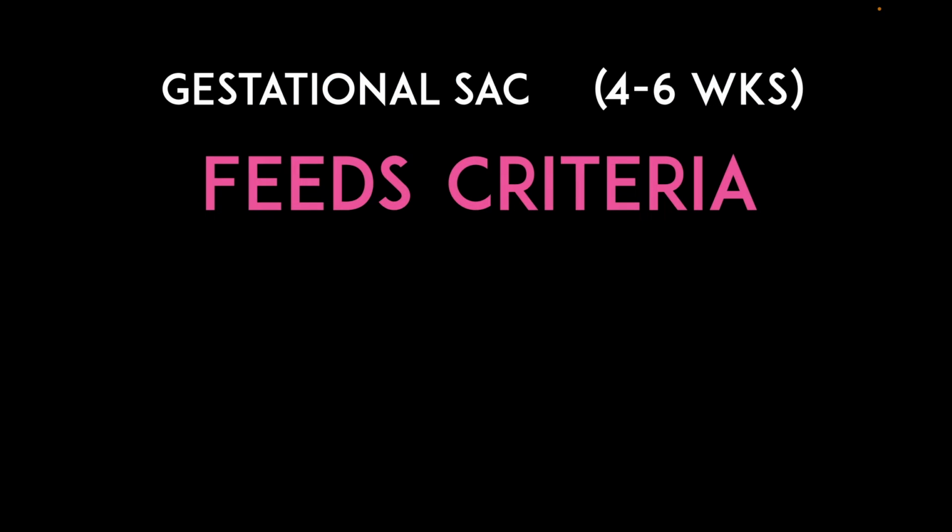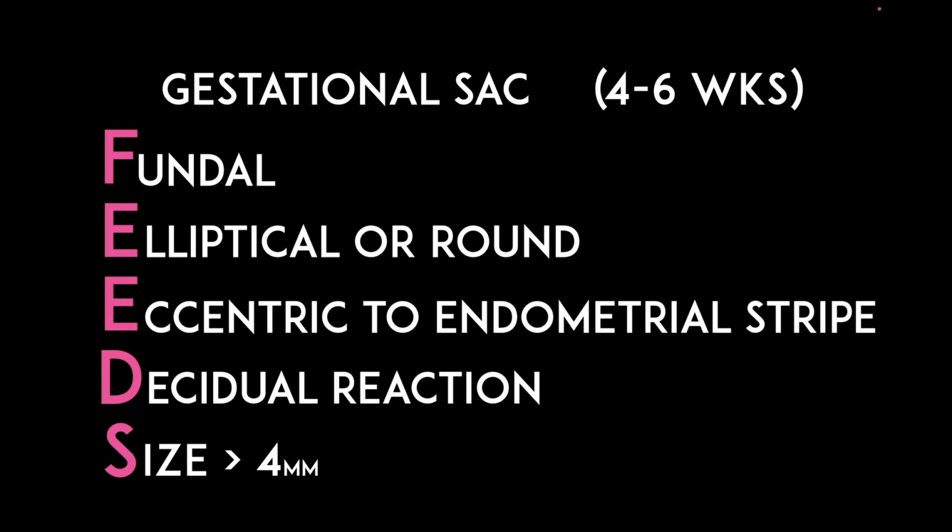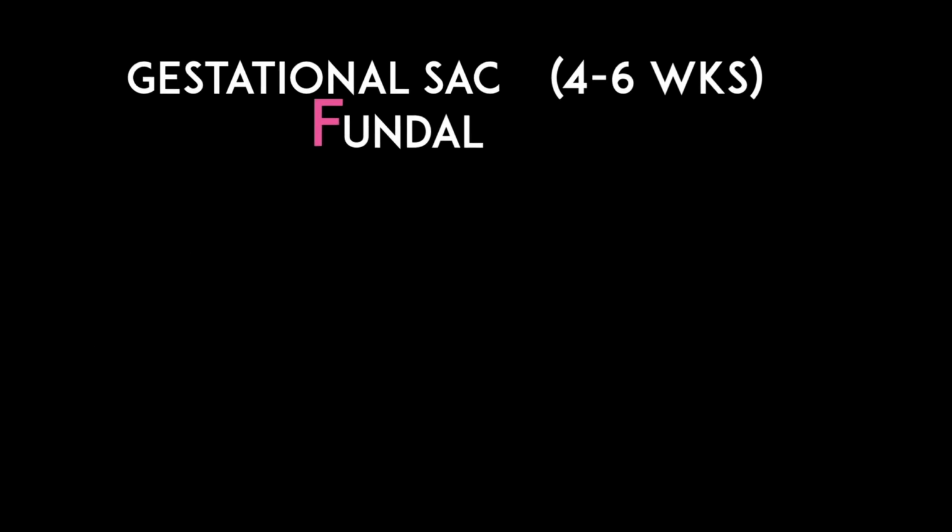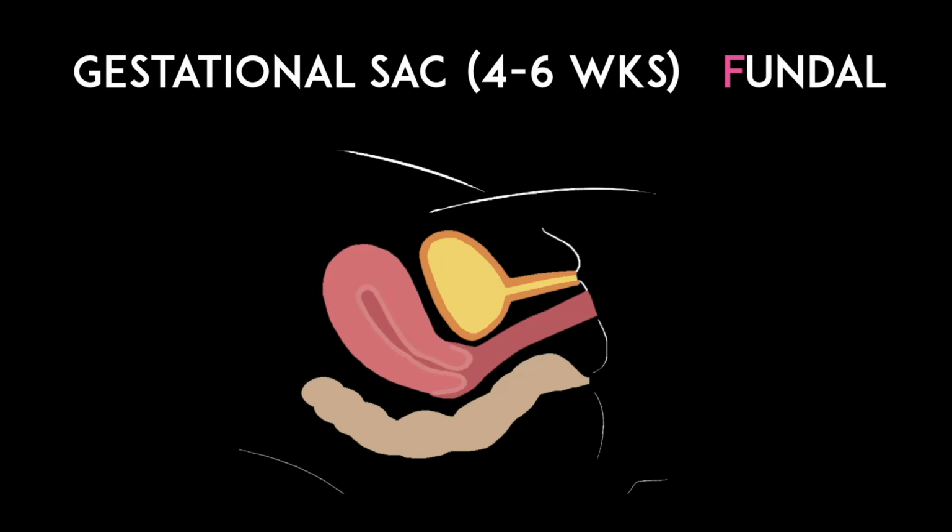There's a way to tell if this gestational sac is actually in the uterus or not, or if it is associated with an intrauterine pregnancy, and you can look at the FEEDS criteria. Now, I actually struggle to find any data supporting the FEEDS criteria, and I couldn't even find an original reference, but it is mentioned in the AAFP guidelines for residencies, and it does seem to be a bit helpful here. So let's talk about it. Now, being fundal has to do with it actually being in the fundus of the uterus, which is kind of the top part right here.